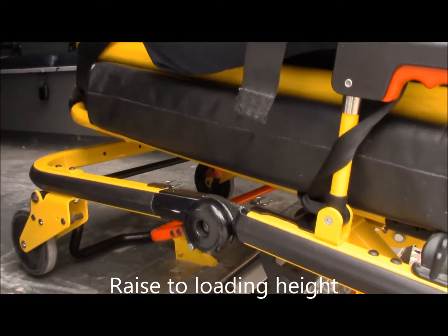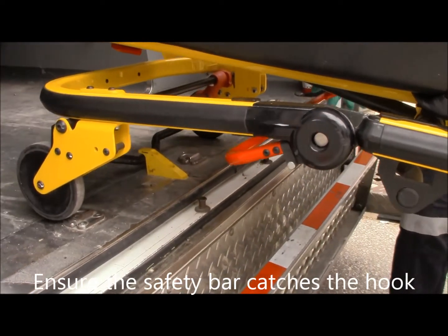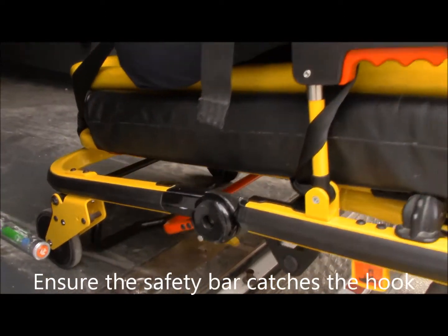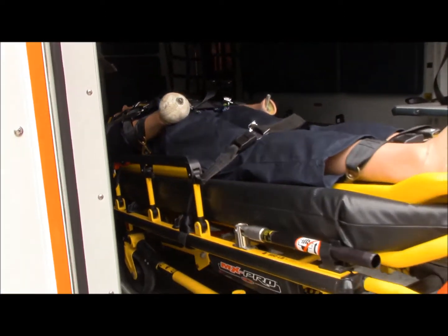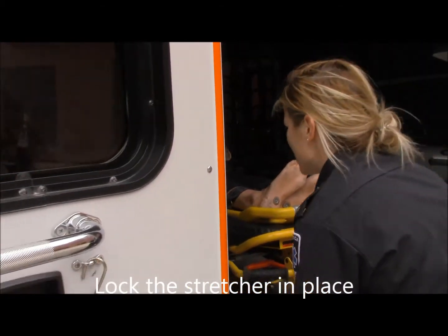We're going to show you the locking mechanisms up close here. Back. Okay, good. Can you pull it towards you a little again? Yep. Come on, 3. 1, first part. 3. And then you'll see Jen will nicely lock the stretcher in place here. Okay, good.